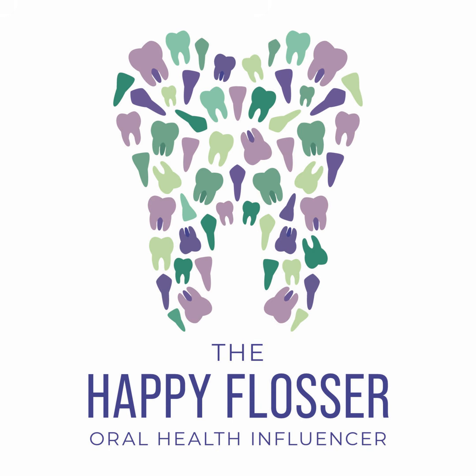Now, if your patient has a palatal torus, place the top edge of the sensor between the torus and the teeth on the opposite side of the mouth, especially if it's a larger torus.